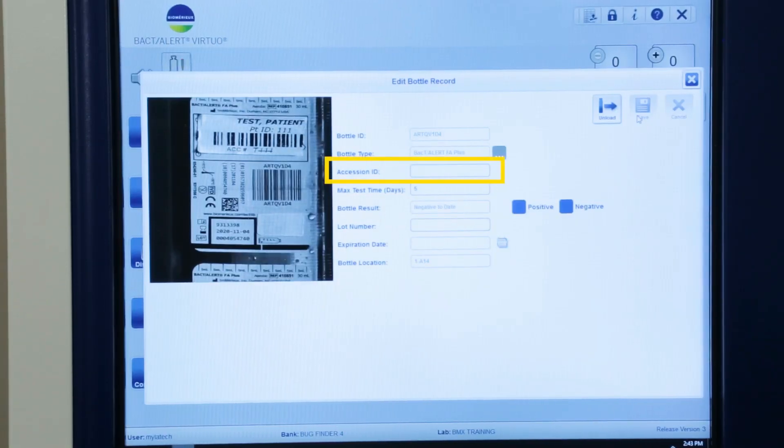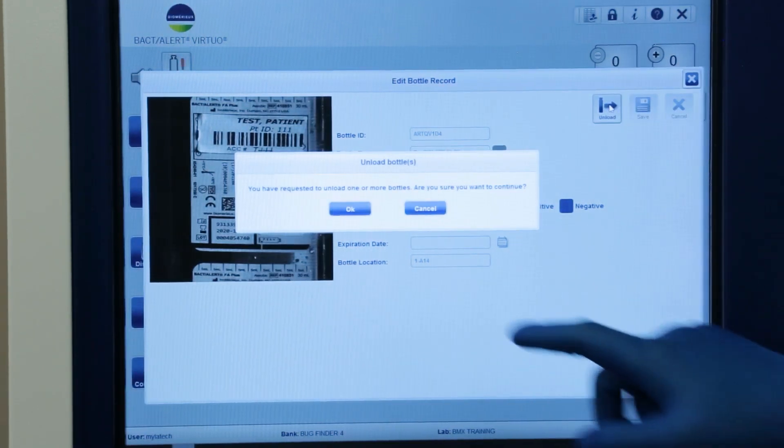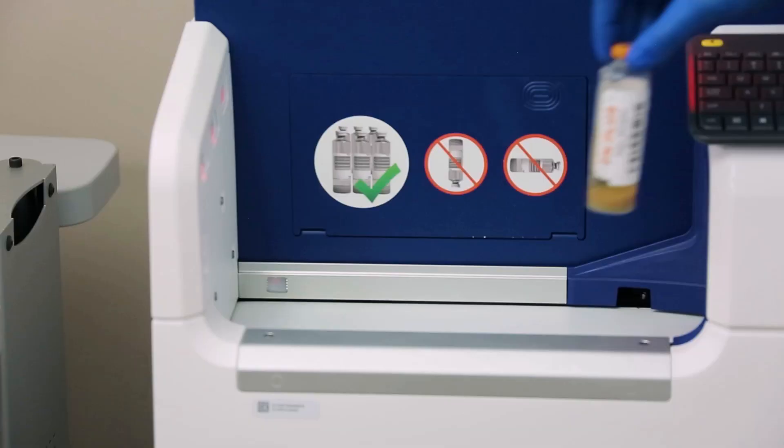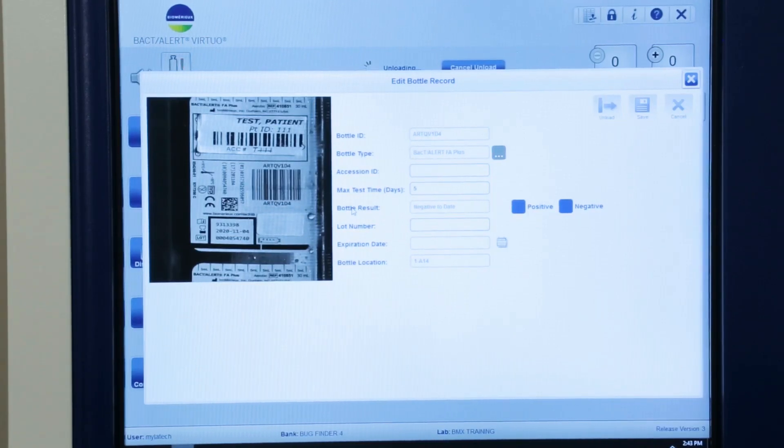If the accession number is not visible, press the unload icon to retrieve the bottle. If the accession number is available, relabel and reload the bottle. If no accession number is available, handle according to your institution's policy.